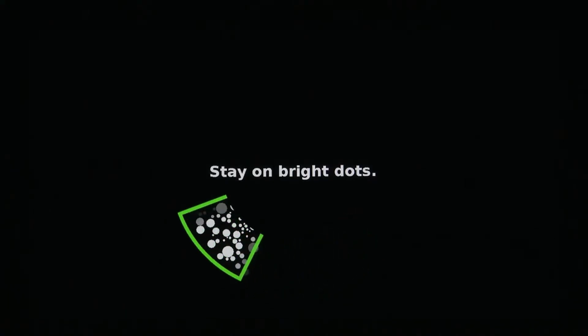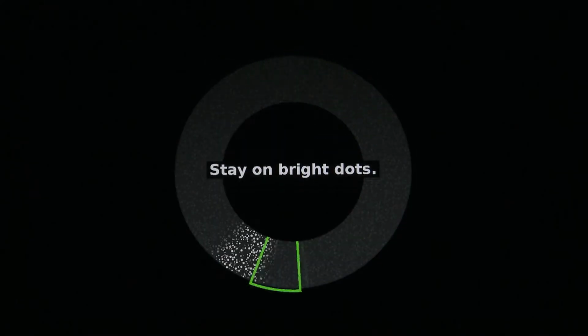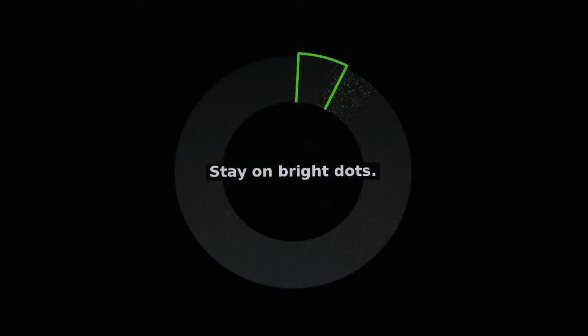The first part of our test is assessing your adaptive motor control to determine the speed at which the test will run. Now we are assessing your visual salience to adjust the brightness to your needs.